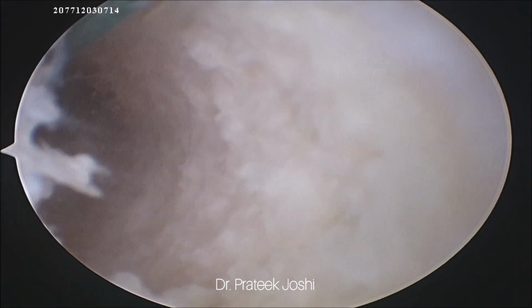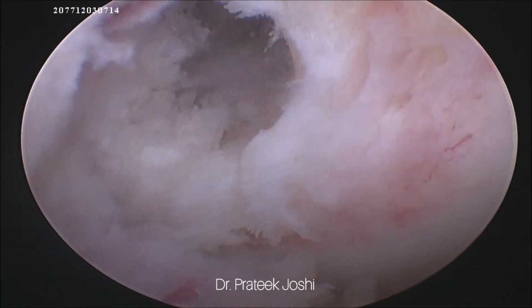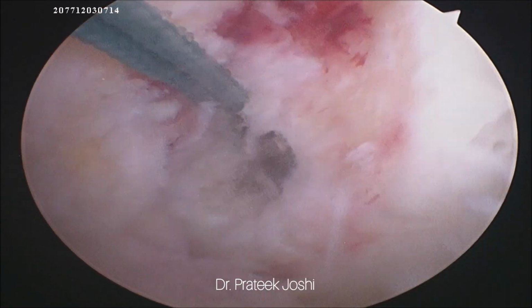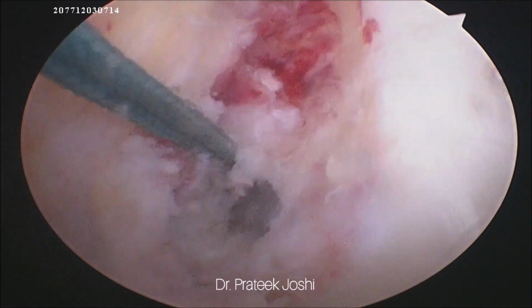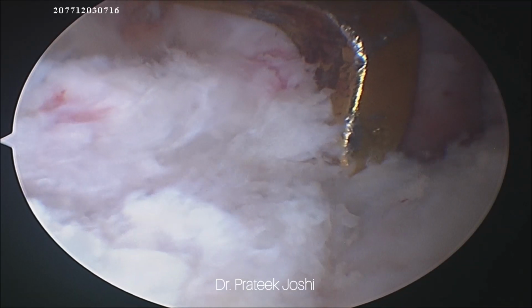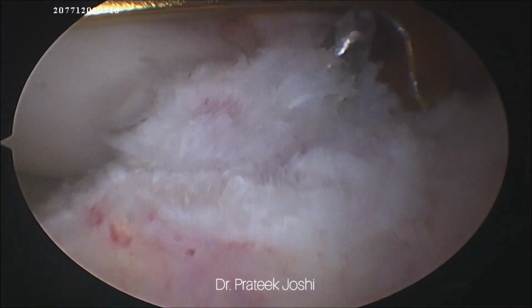So this is the view of the femoral ACL tunnel as seen from the anteromedial portal. You can see that it's in its anatomical footprint. So this is a good femoral ACL tunnel, and it should give good stability for this patient after ACL reconstruction.